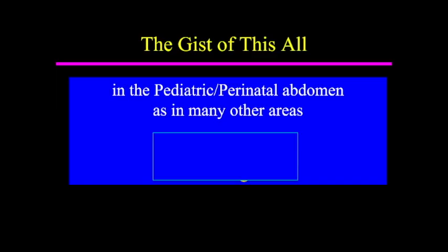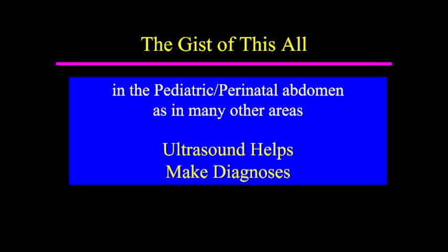So the gist of this all, and I think it's pronounced gist, in the pediatric/perinatal abdomen, as in many other areas, ultrasound helps make the diagnosis. The end.